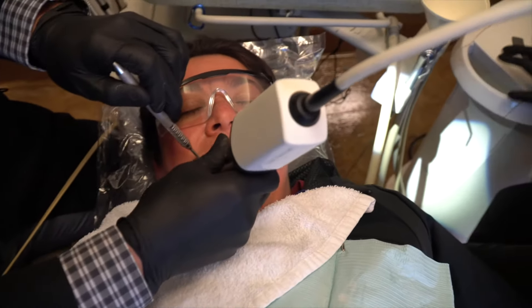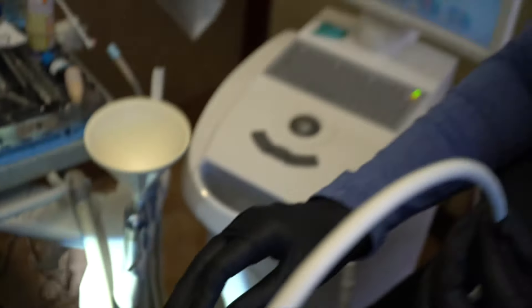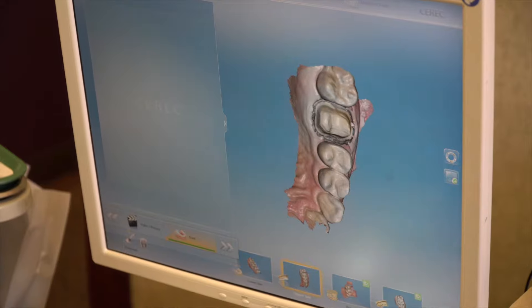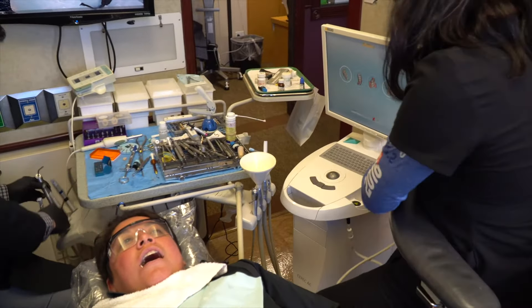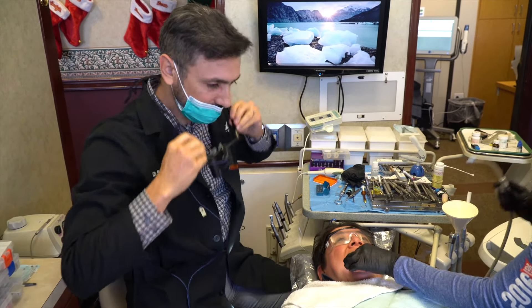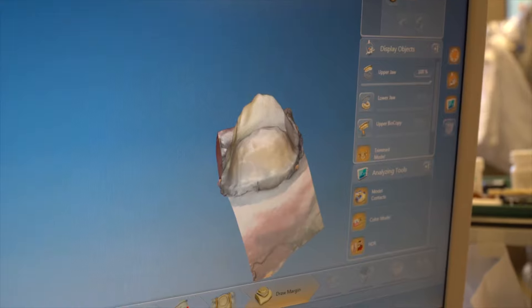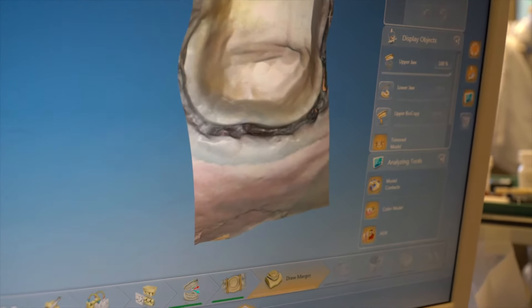Now we're scanning the tooth we prepared after we cleaned it up. The computer is going to take the digital scan and make a 3D model that we can design our crown from. Since the crown was structurally okay overall, we're going to pretty much copy the design that works for Jackie. The CEREC has calculated our model and we've got really nice visualization of these margins, which is one of the most important parts of the crown. We're going to draw our margin — we did a lot of gum work to be able to get this kind of image.